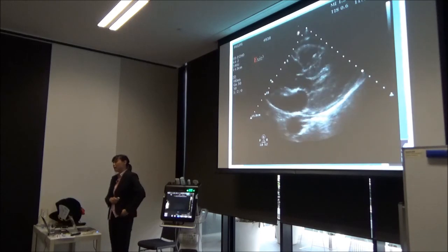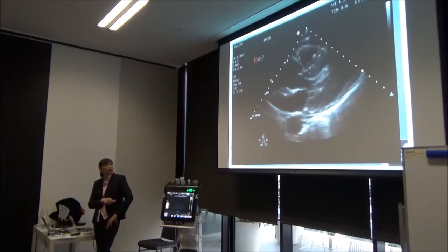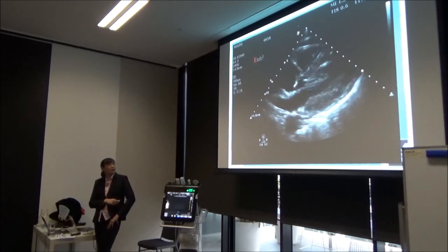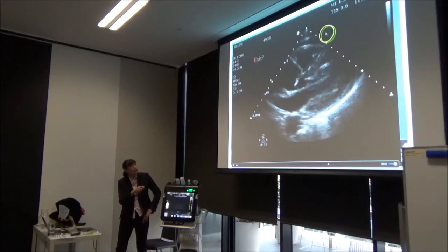They actually did a pericardiocentesis before shocking. And even though it was clotted blood, I don't know how they did it, somehow they managed to suck up some of the blood, shock it, and they got ROSC. Does anyone here see a reason why this happened in the first place? So we haven't quite talked about this yet.